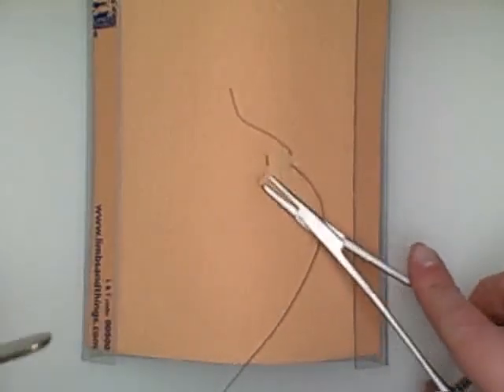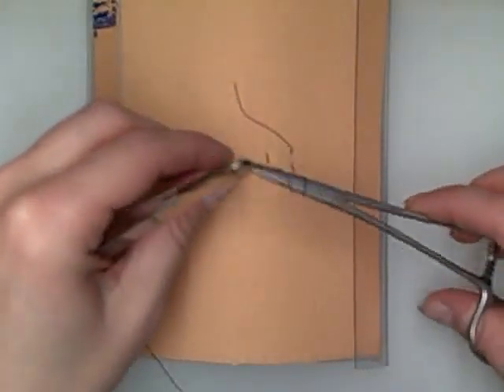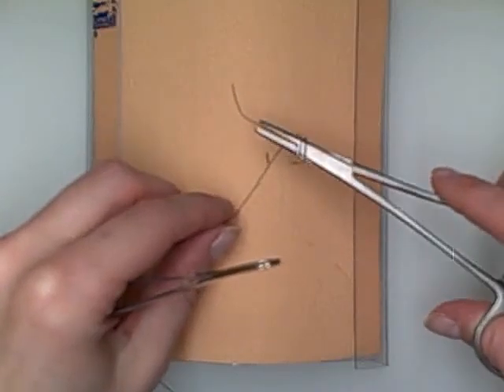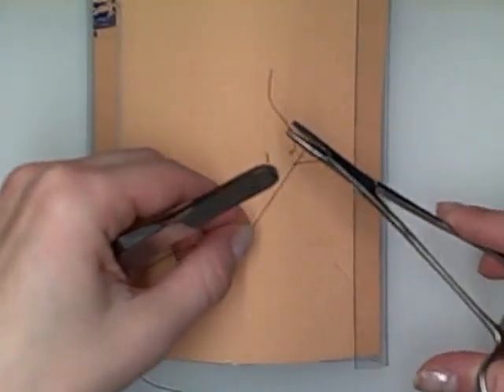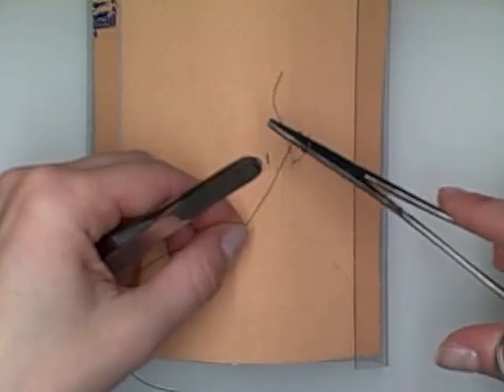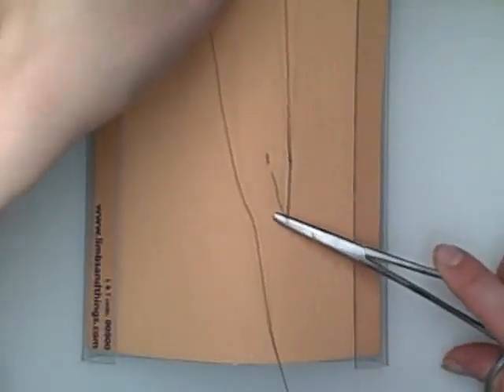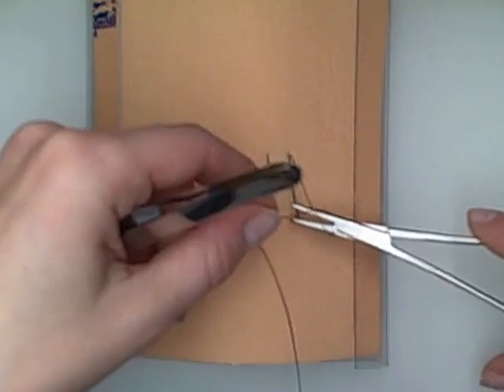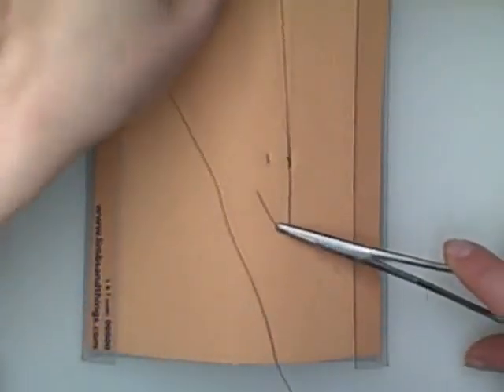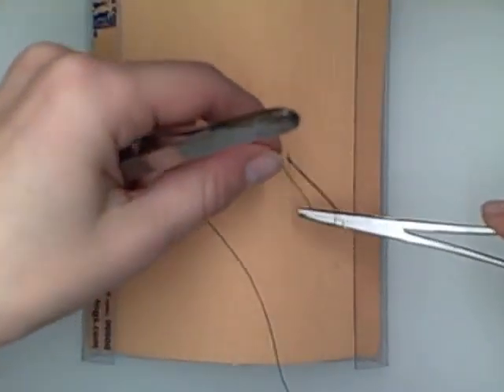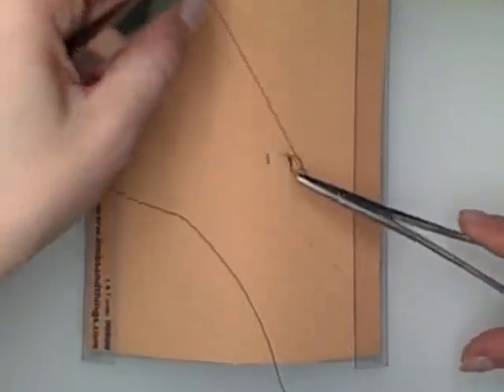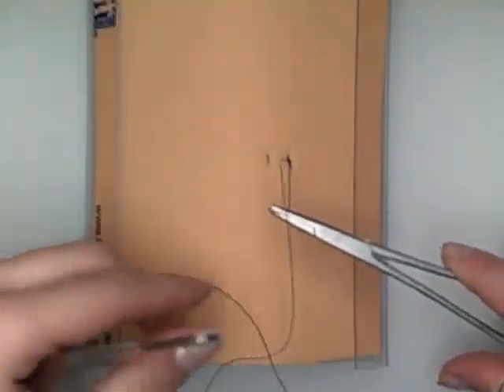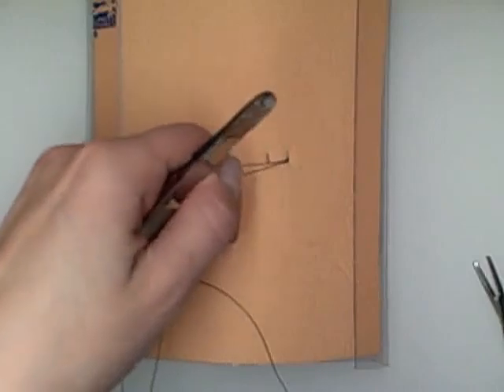Okay, so now we're going to do our instrument tie. If I can grab it. I'm going to flatten out the knot. Then we're going to cut it.